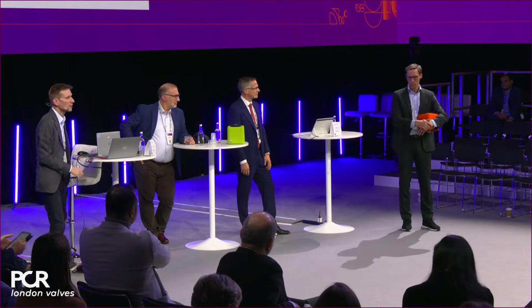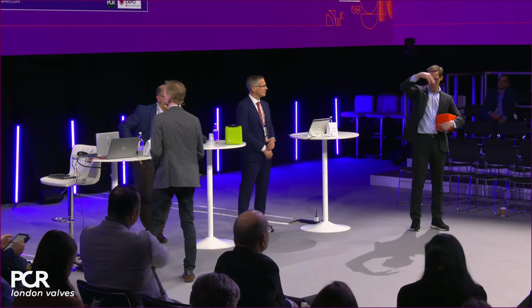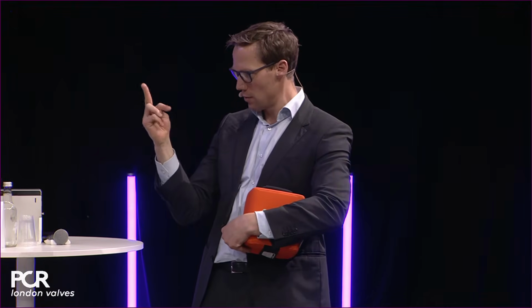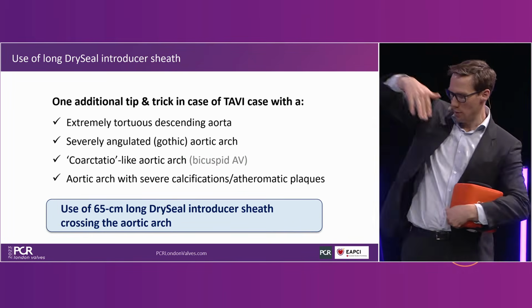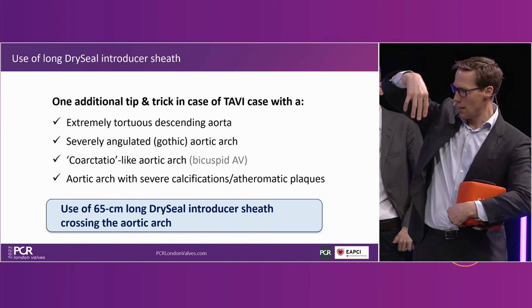The other thing is to remember that the stability layer that sits on this new system now is stiffer. So yes, we've taken out a spine, so there's only one spine now, but the stability layer actually coming around the arch that ends at the top of the arch actually is stiffer. So that gives you that more coaxial alignment. So whether in these type of very hostile anatomies, going with a slightly different wire is beneficial or not, I think we have to learn that, right?